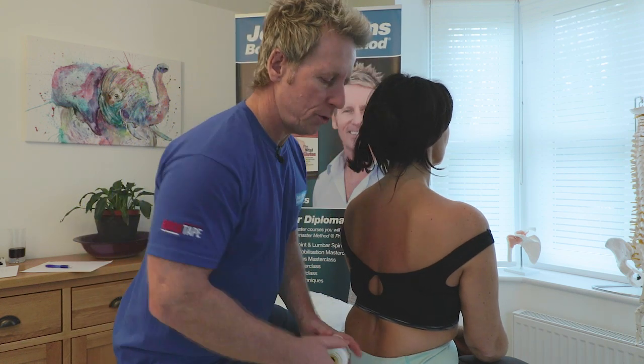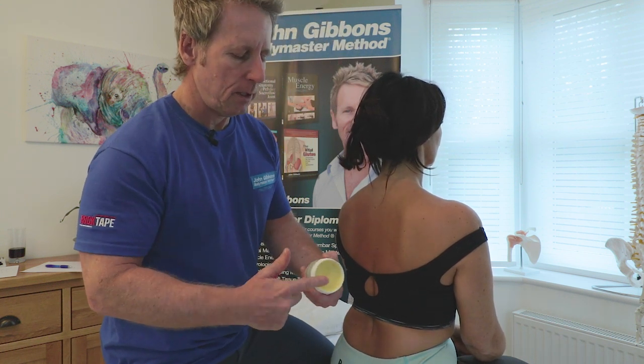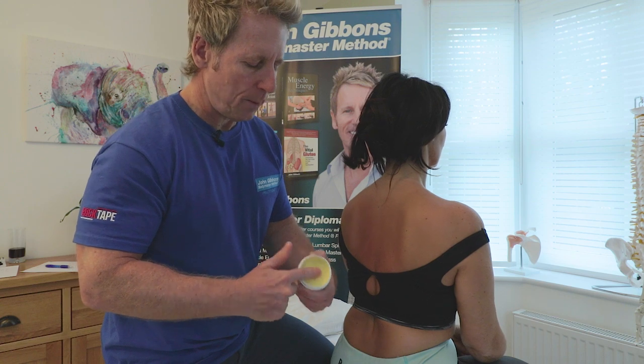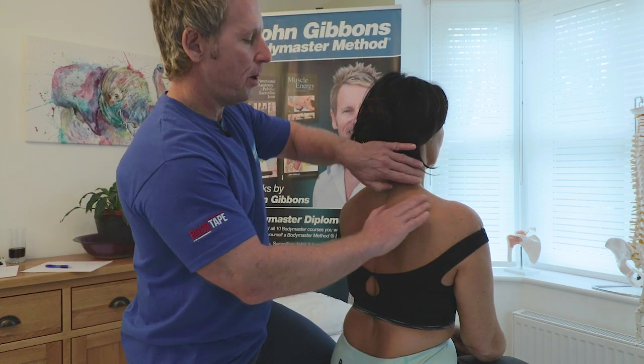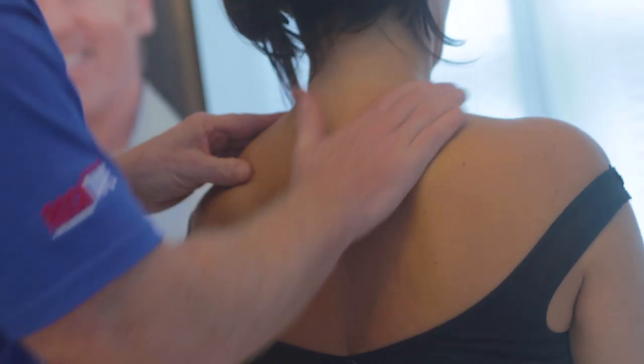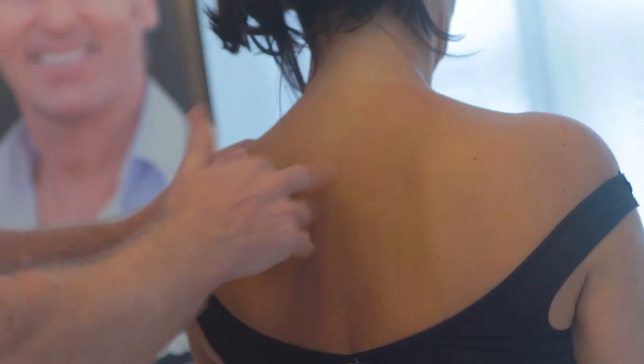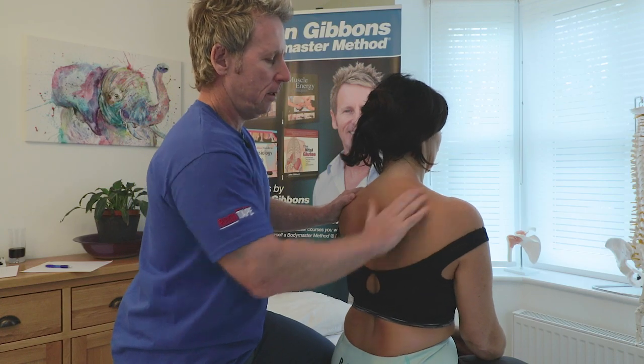First of all we are going to apply a little bit of wax — we don't need much. Just place a finger rather than digging it in, just wipe it on the wax and apply it to an area so we have a sheen on the skin rather than it being shiny. If it's too shiny you'll start to slip and you won't have any grip.